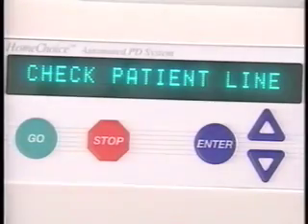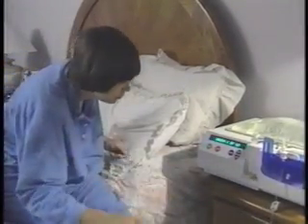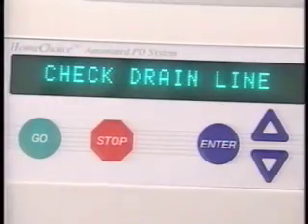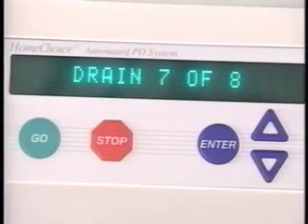If not, there is a second alarm. Again, when corrected, the machine will automatically restart. Should the problem persist, the machine alarms a third time, and the stop button must be pushed to silence the alarm. When the condition is corrected, press go to resume the therapy.